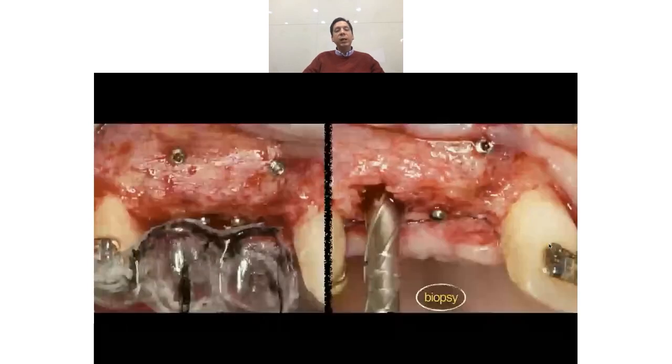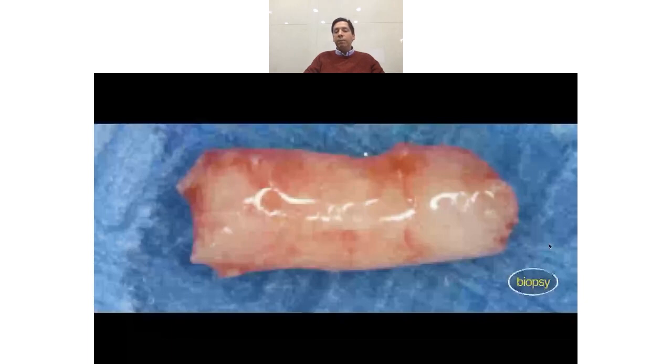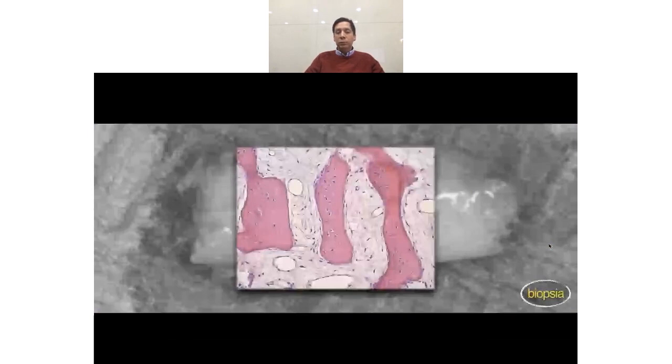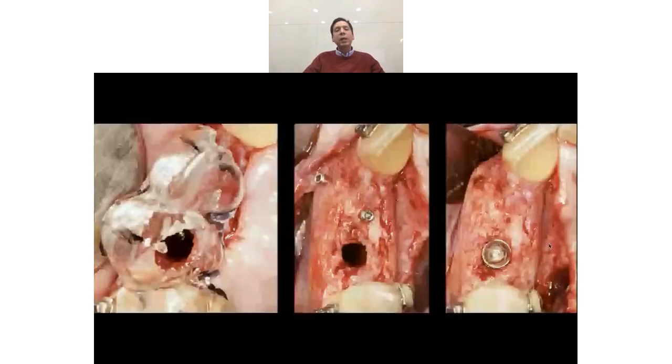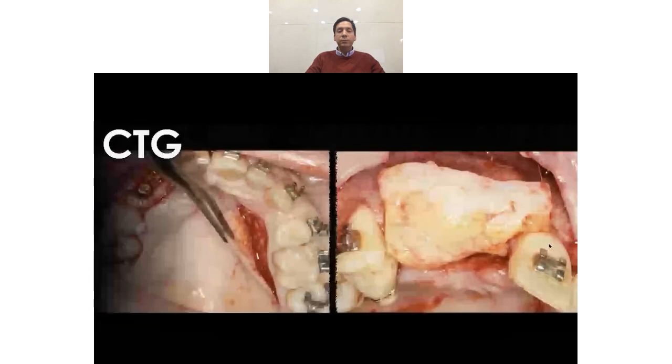So now we're gonna place the implant, and when we drill the bone, we use this hollow trephine. We harvested this biopsy, and we analyzed this biopsy, and it says that it's totally vital bone, with vessels, osteoblasts, osteocytes, etc. So in this case we place only one implant, in the canine. It's a 4.2 millimeter implant, I think 13 millimeters long. We see the implant here in the right position, in the right three-dimensional position.